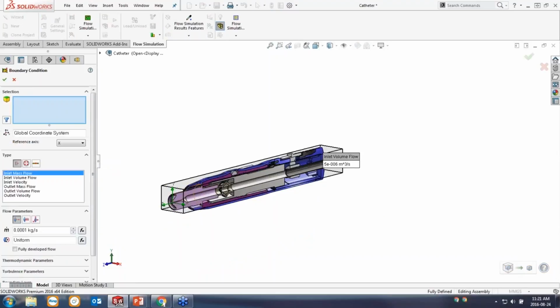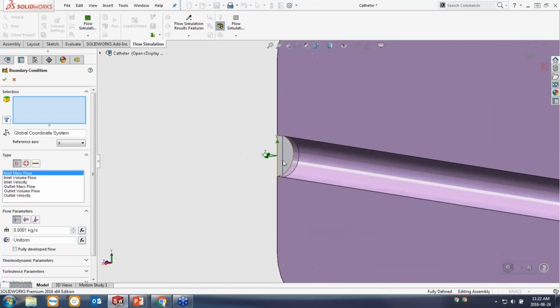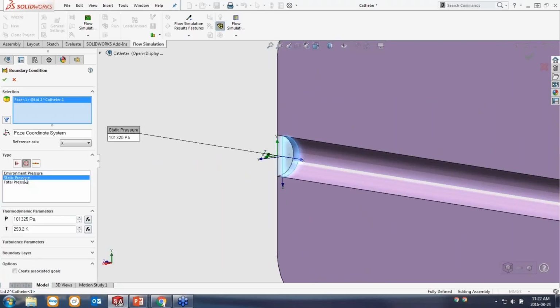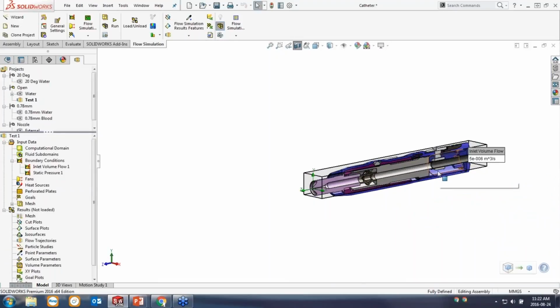My other boundary condition is going to be on the other end of the device, on the exit. And here I'm not going to be specifying a particular flow rate, I'm just going to be setting the pressure. We'll assume that this thing is injecting into static atmospheric pressure. Maybe if you're injecting this into intramuscular, you'd want to set a different value here. I'm going to click OK for that, and that'll be our assumption for this analysis.